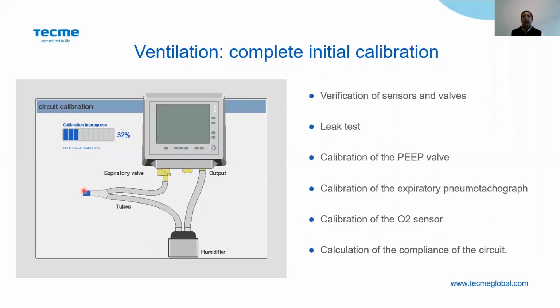During this initial calibration, the machine is going to do a sensor and valve verification. It's going to make a leak test.